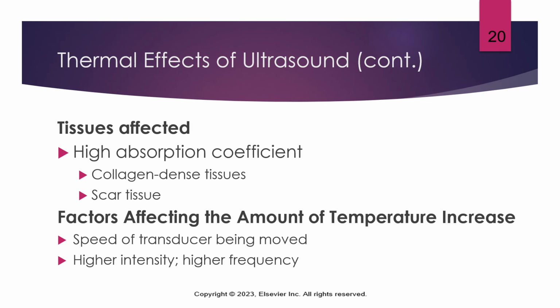The other thing that affects the temperature increase is the intensity, so that watts per centimeter squared that we were talking about. A stronger output of energy leads to more heat. So if you really crank that intensity up, just be aware that there's a higher risk of burning some of those tissues in the area. So it's really important with higher intensities that you keep that ultrasound head moving and that you try not to create those standing waves that we talked about that happen with reflection.